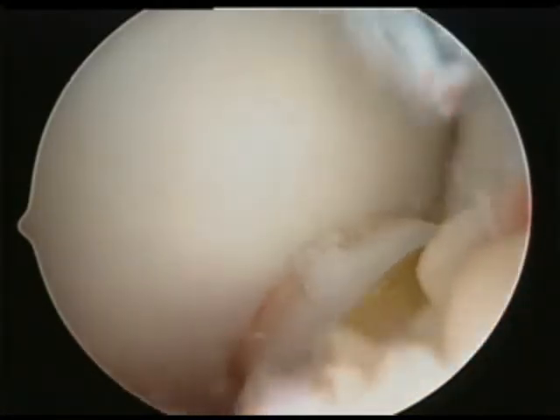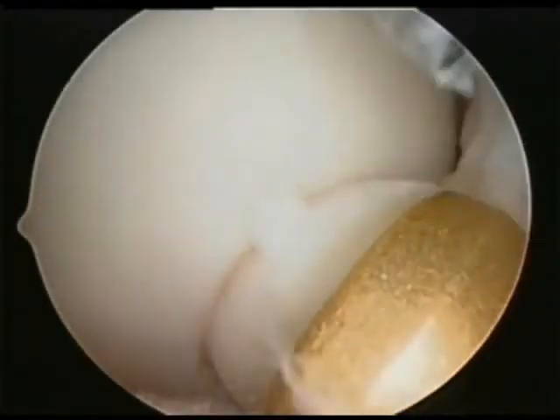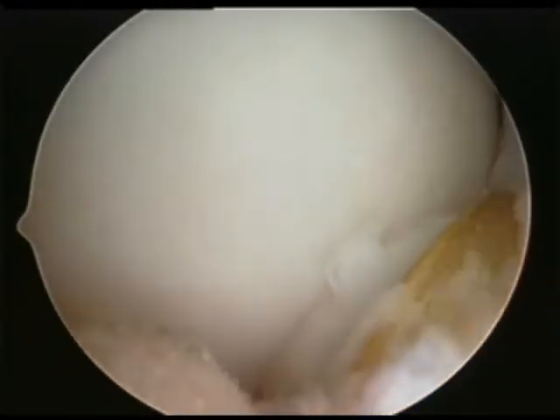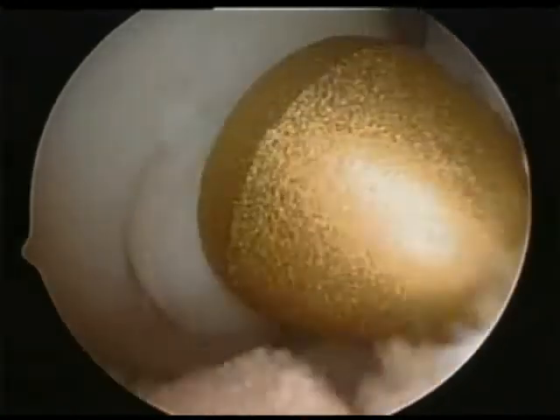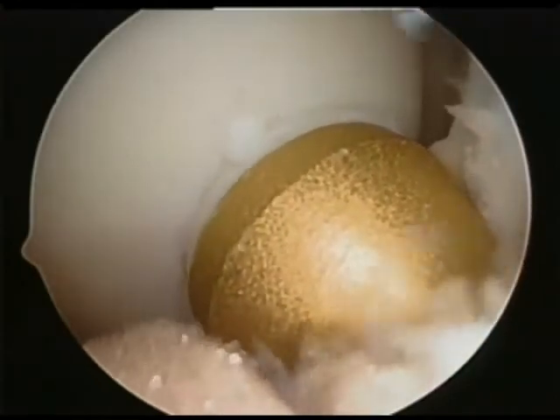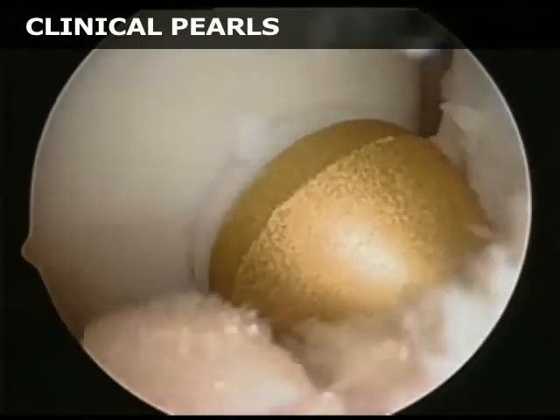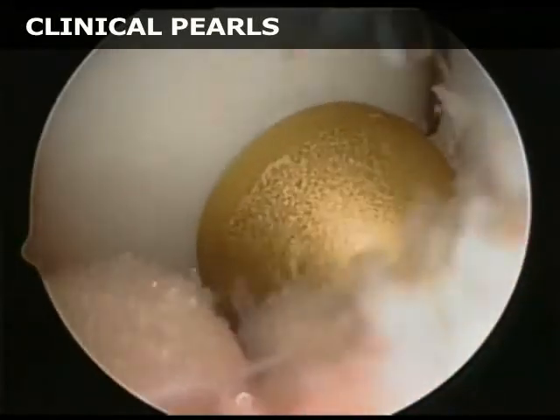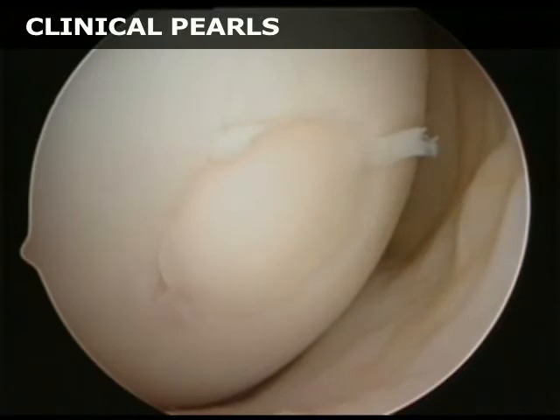Position a sizer tamp measuring at least 1 millimeter in diameter larger than the diameter of the bone core over the bone core. For final seating of the bone core, flush with the surrounding cartilage and tap the tamp lightly with a mallet. Great care is taken to avoid over-impaction or excessive levels of load during this impaction process, which might otherwise compromise chondrocyte viability.